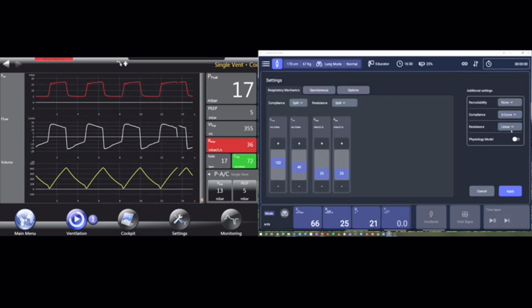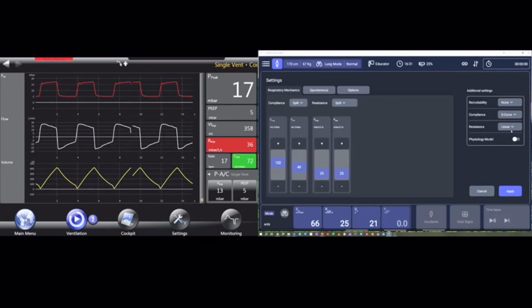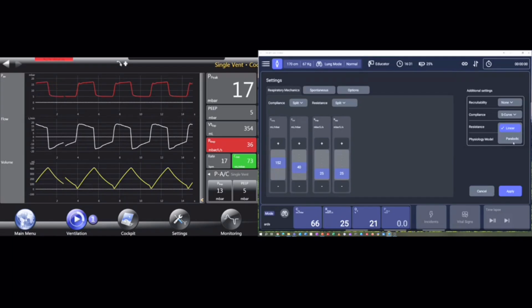So now alveoli is around 10K of alveoli mathematically modeled, and they open and close like a real lung, and they are shaped in a way a normal lung would open. And we can also do this with the resistance. We can do linear for laminar flows, for lower flows, but we can also do parabolic for turbulent flows. But I keep this for linear.